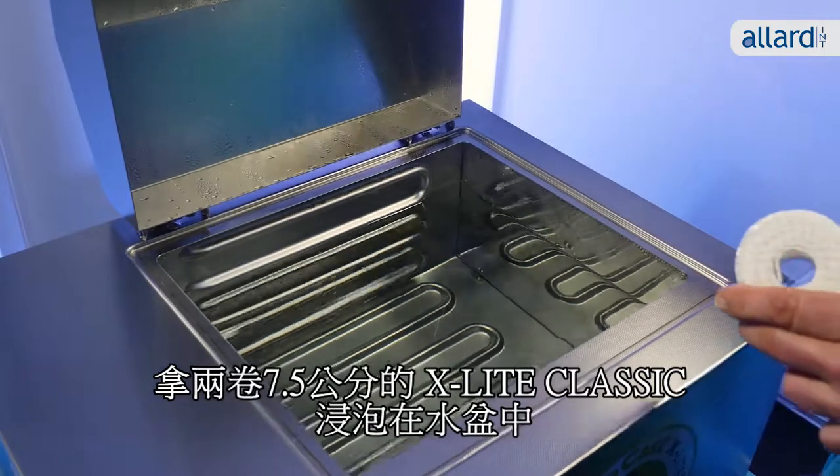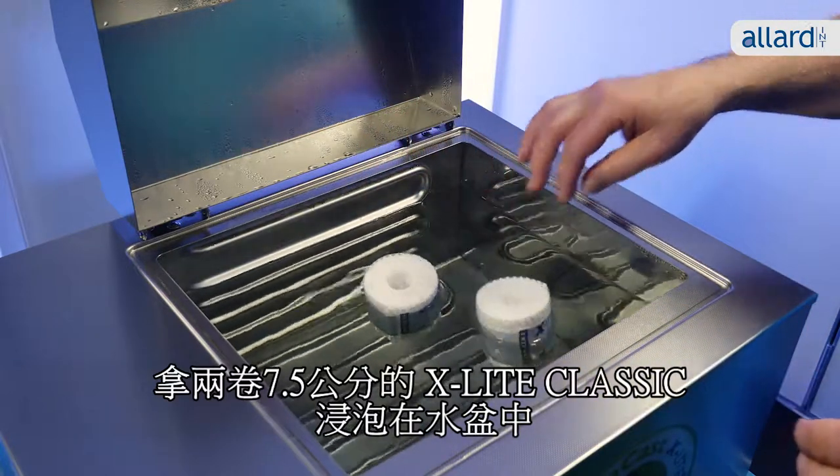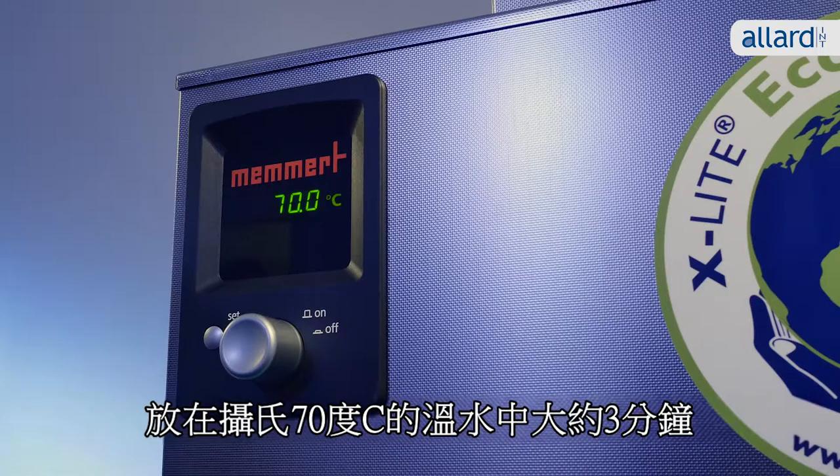Take two rolls of 7.5 cm X-Lite Classic and immerse them in the water bath for approximately 3 minutes in 70 degrees Celsius warm water.